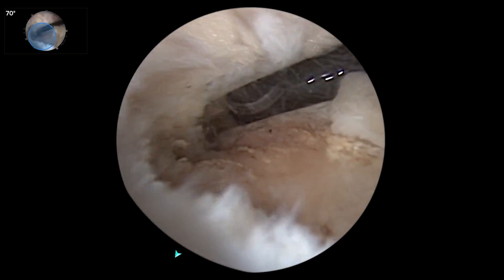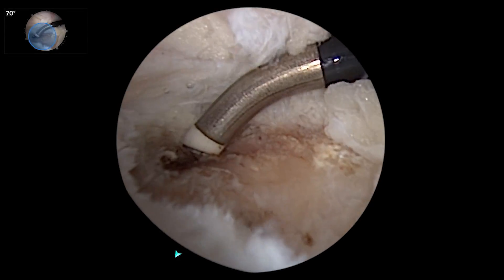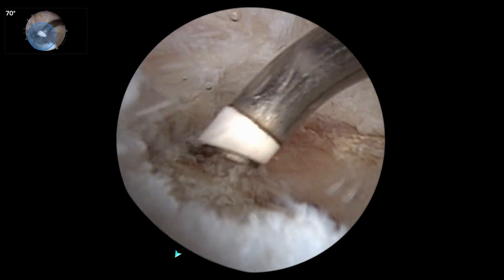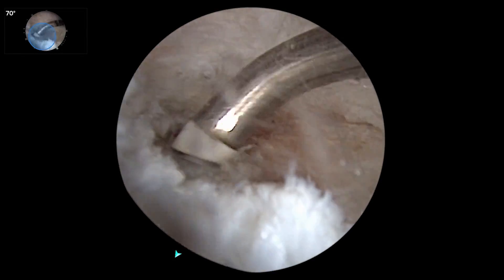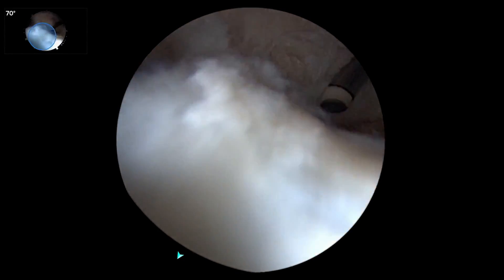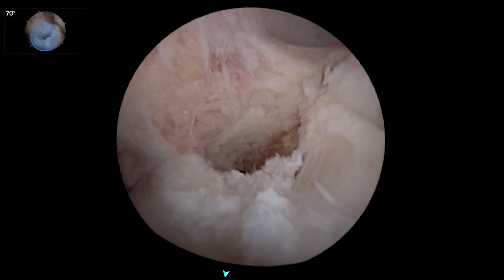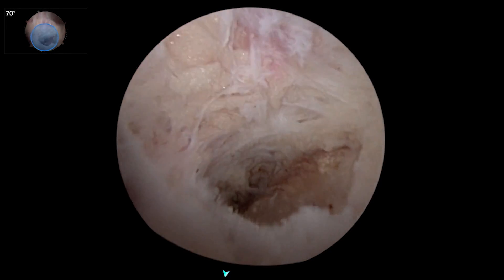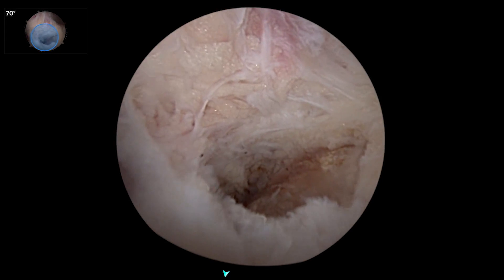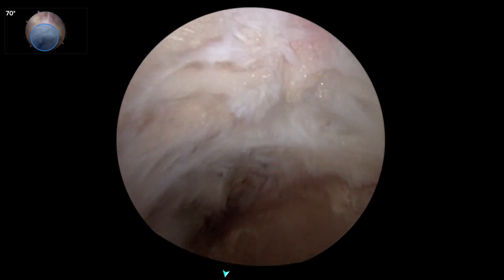For me doing a PCL, this view always had to happen through the posteromedial portal — I just can't get this view even with the 70-degree scope. The ability to widen the angle gives you this perspective. That's the root of the lateral meniscus looking down, root of the medial meniscus. And you can see anatomically how that PCL insertion of the tibia is a little medial of center — and that's where the tunnels for reconstruction have to go.